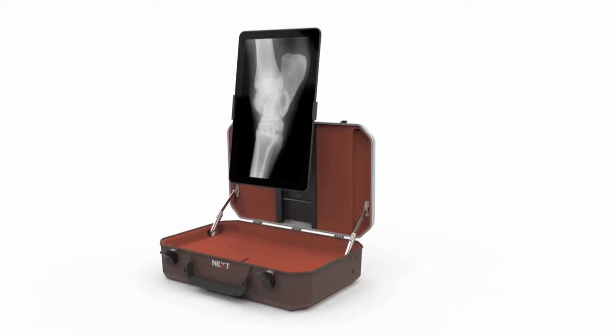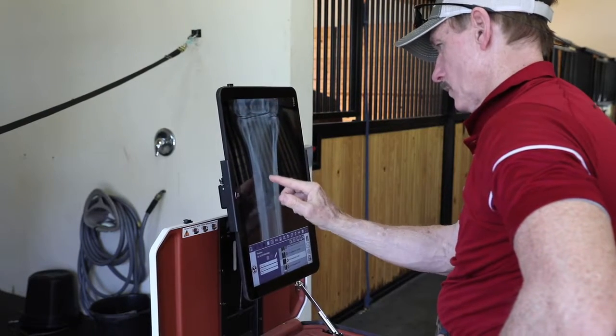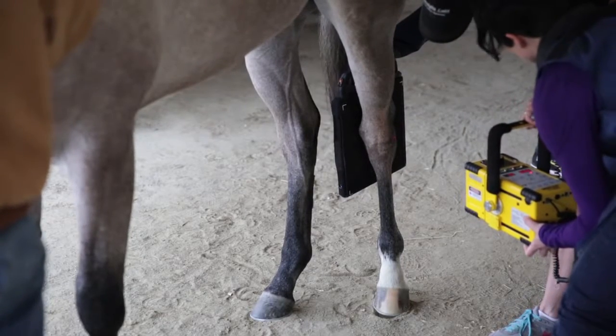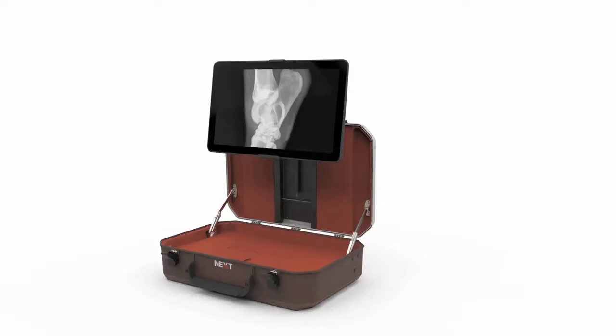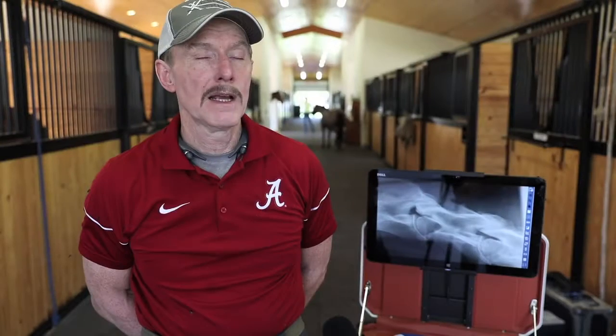This is the best monitor that I've seen on any system. The screen being able to rotate is great because when you're looking at feet or stifles, you want the screen upright. Because of the way that the equine limb is built, it's vertical. And because of the ability to shift the screen vertically, I don't really have to attenuate the images when I'm looking at them while we're taking them. And when you're looking at cervical spine or dorsal spinous processes, you can rotate the screen horizontal and you're looking at it the way it is in the horse.